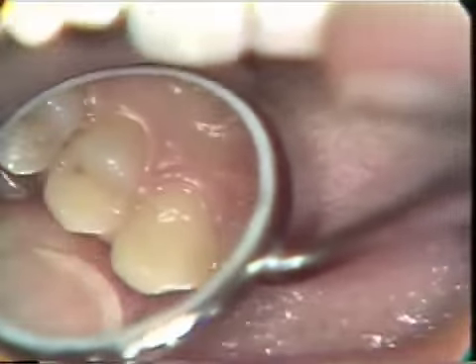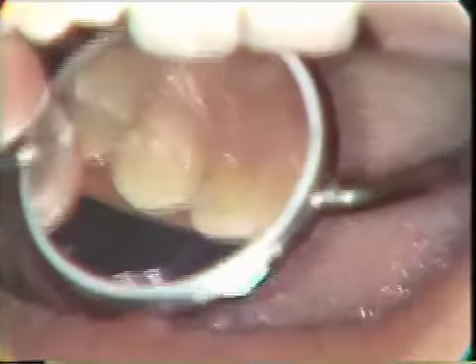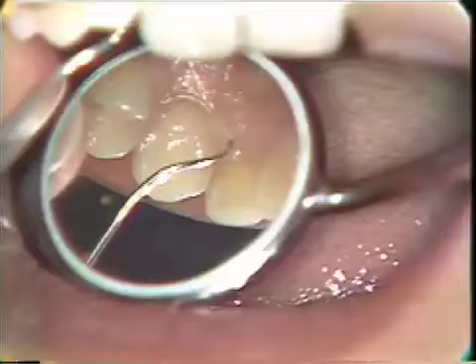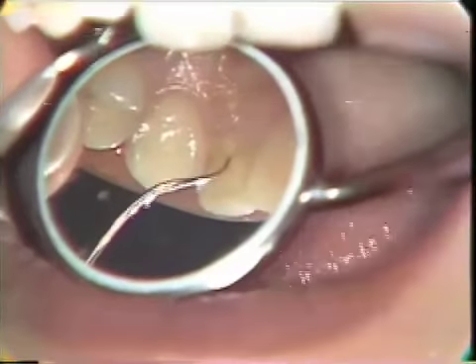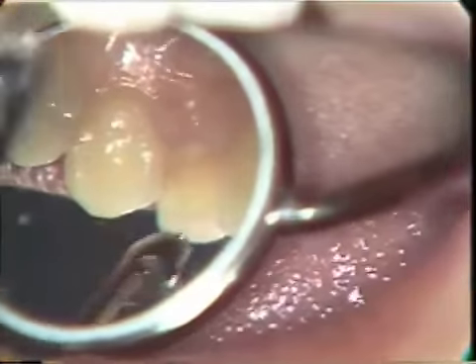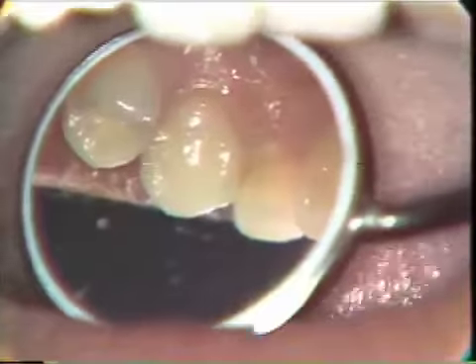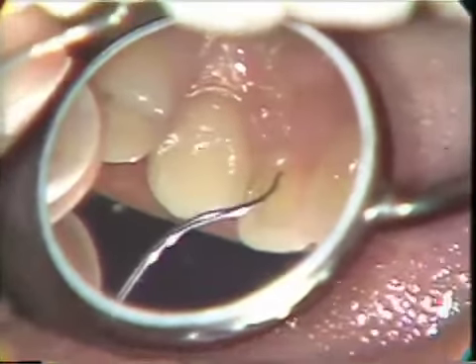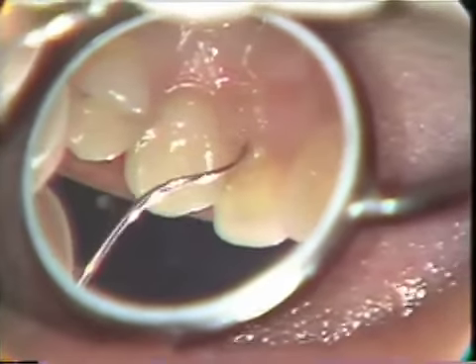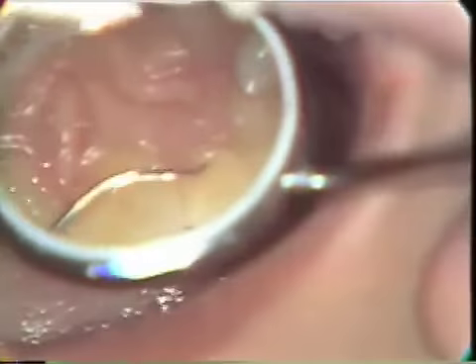As we continue now, we can examine the labial surfaces of the anterior teeth, and in the mirror we can examine the lingual surfaces. We note the form of tooth number 7 on the lingual side. Let's dry that with a little air. Here we see the heavy cingulum. This is the radiopaque area that appeared on the periapical film. Also a heavy cingulum on tooth number 10.